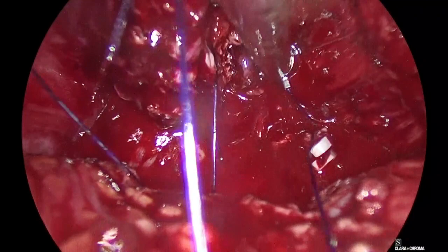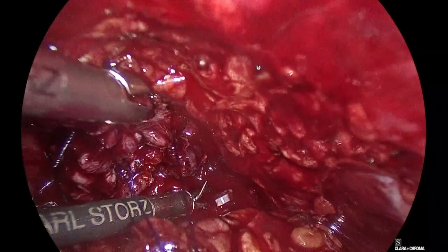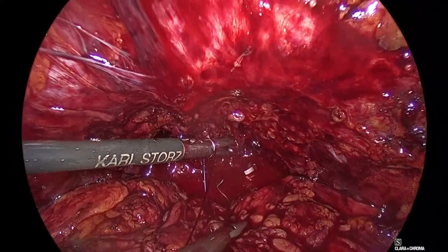It's not good, the tampon, but it doesn't matter. Go back. No. The tampon is not good. Tampon is not good. Let's coordinate ourselves again. No. Aspirate. Panagiotis, aspirate and do the tampon, please.